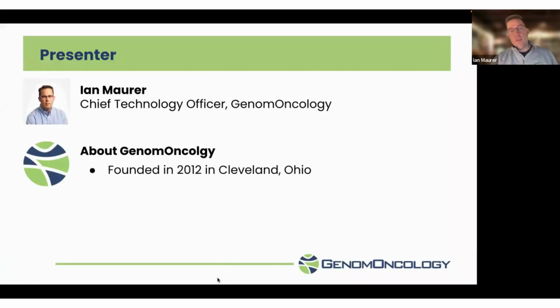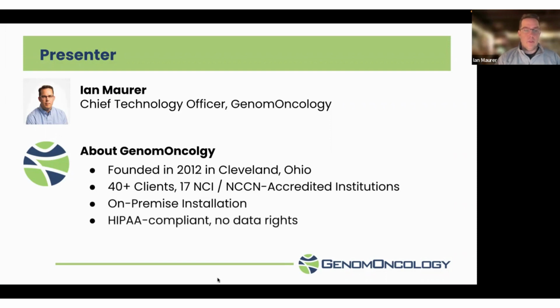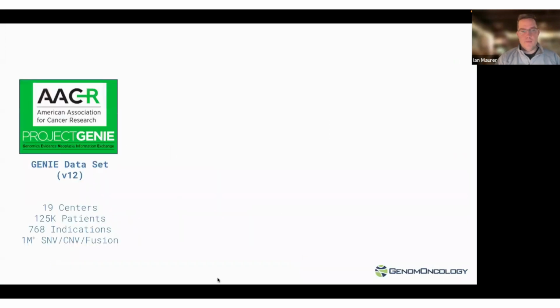GenomOncology was founded in 2012 in Cleveland, Ohio. We have over 40 clients, including 17 NCI and NCCN designated cancer institutes. Our software can be installed on the cloud or on-premise behind your firewall. Our solutions are HIPAA compliant and we take no data rights.